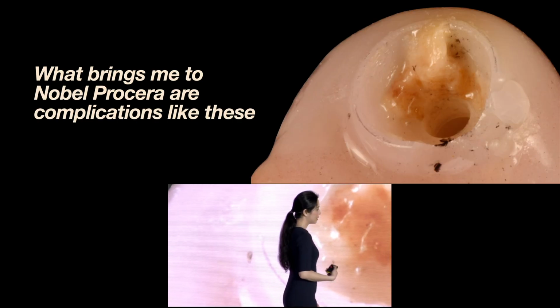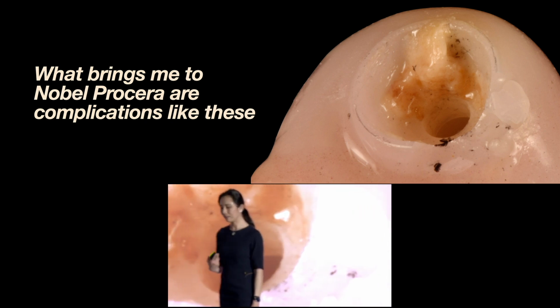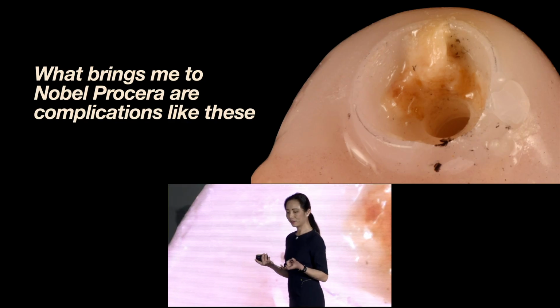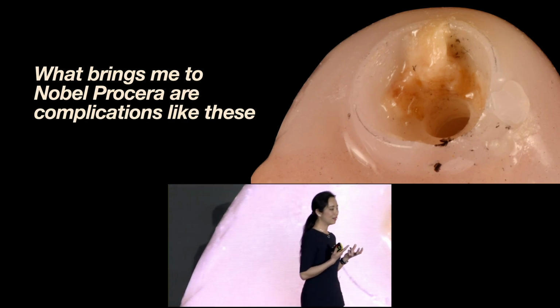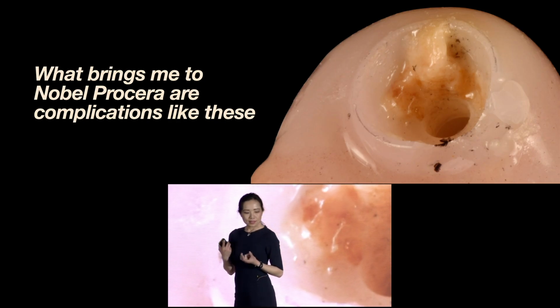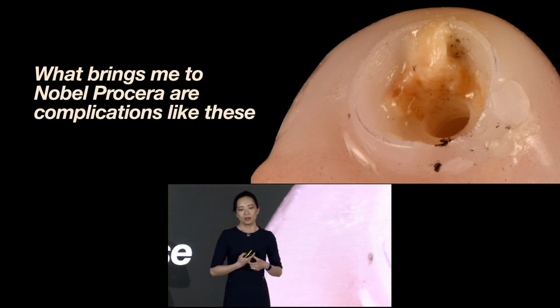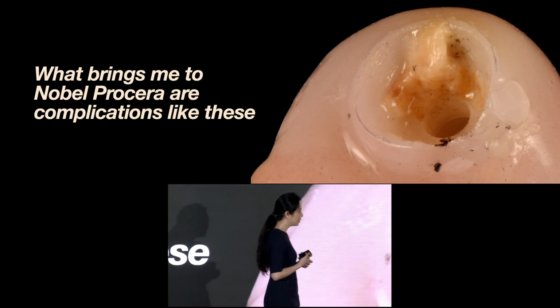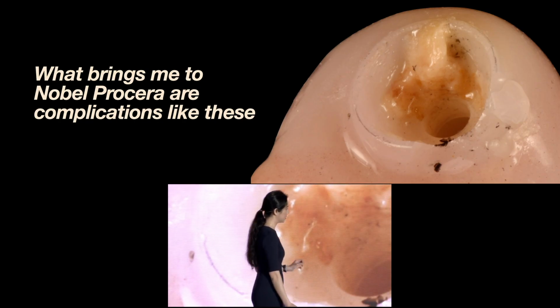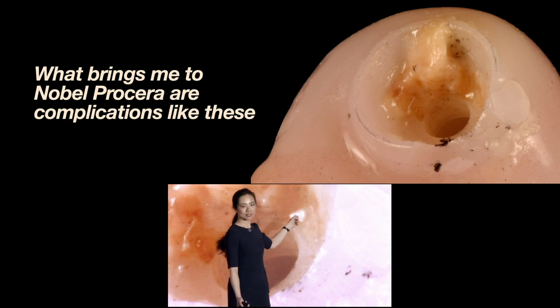So what brought me to using the Procera framework was two things. One being that I was trying to figure out how to get rid of that junction between the tie base and the zirconia restorations I was inserting, knowing that we have very limited control of three-dimensional shrinkage. So this is actually a complication I handled in the past year, where when a lab tries to mill and sinter its own zirconia, even with perfect data sets, such as implant positions, we don't have control of sintering shrinkage, so you wind up with chipping and misfits that way.